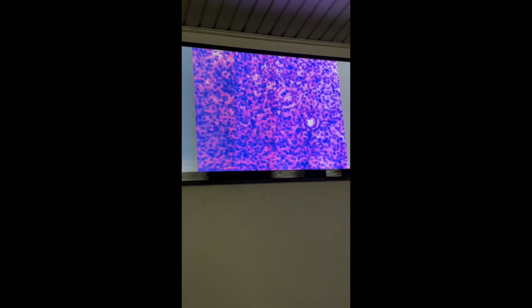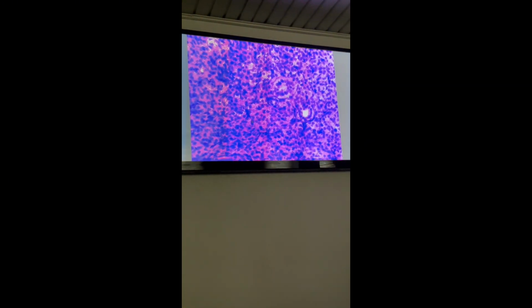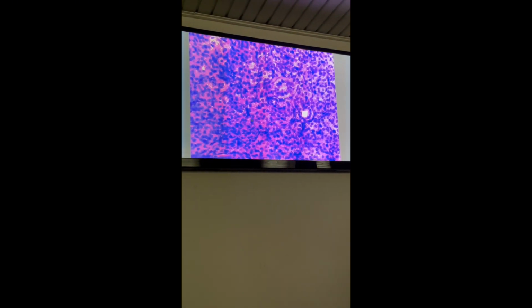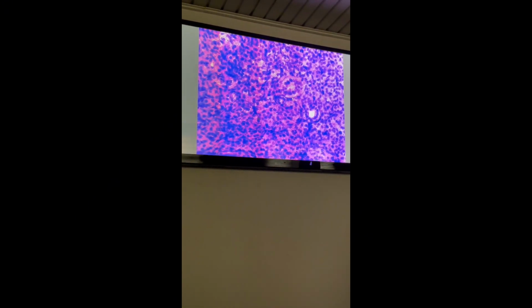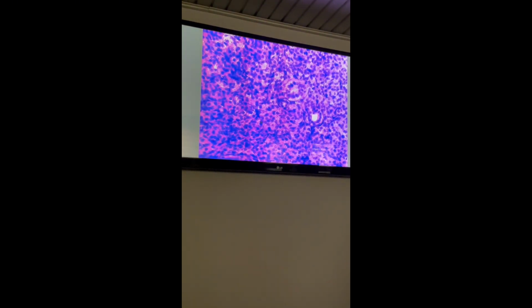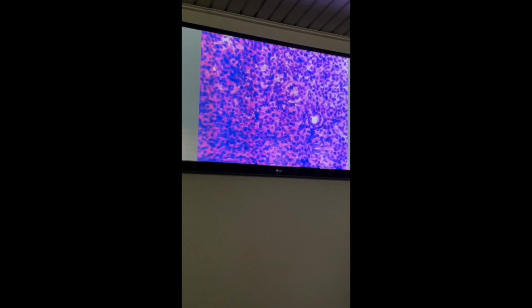The whole structure is called striated duct, characterized by the presence of basal striation. This is intercalated duct, and this structure is striated duct. Both intercalated and striated ducts are called intralobular ducts because of their location within the lobule.